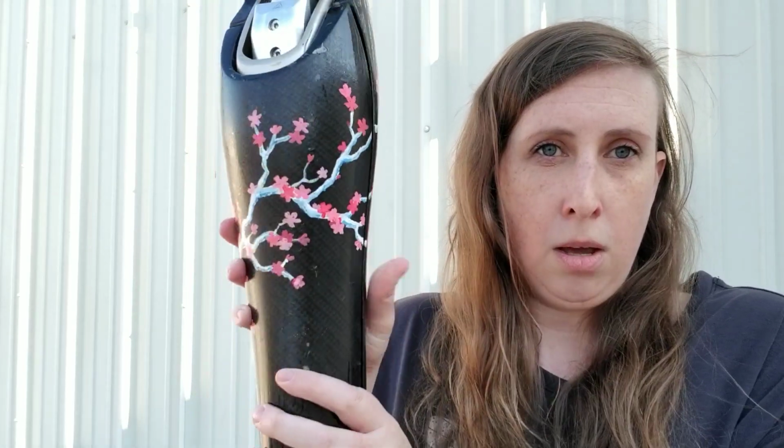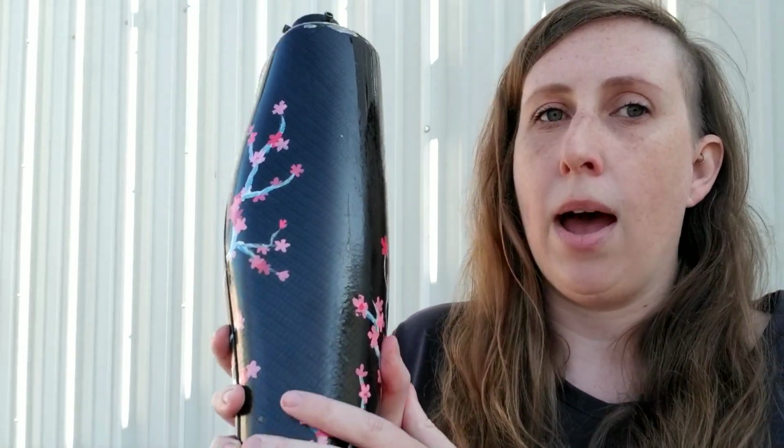So I had the same tattoo artist actually make me a new design. So he ended up using acrylic paint and did a more feminine design on it. I had to play around with the protection of it. For both of these, I did a plastic spray. It was like a playground plastic spray that you spray on your playground stuff so that the paint doesn't get all messed up. That worked fine on this, and there was no issues. There was no discoloration or anything like that.